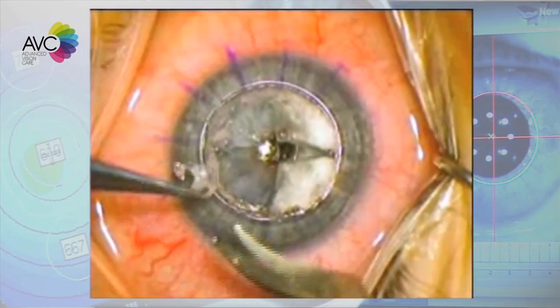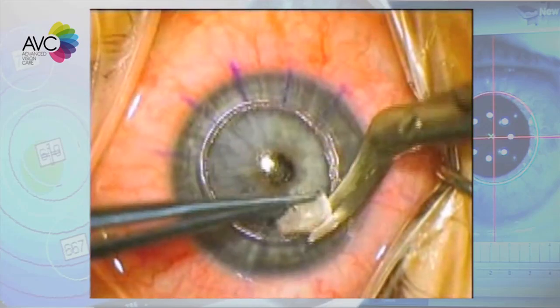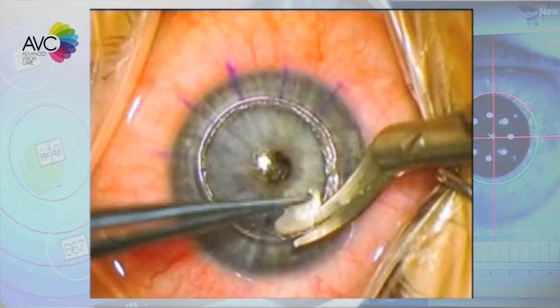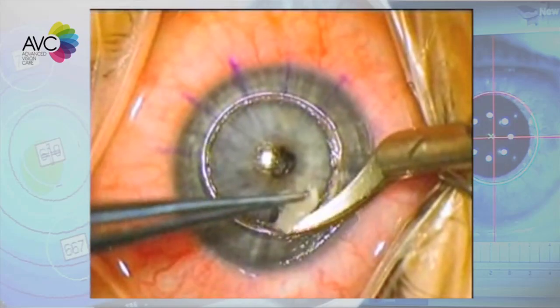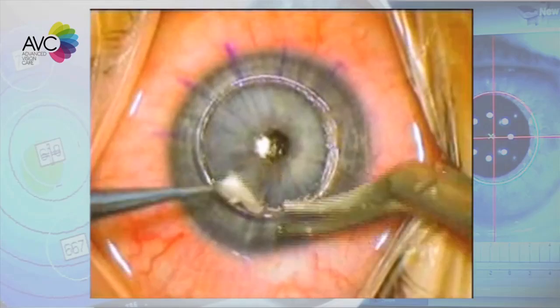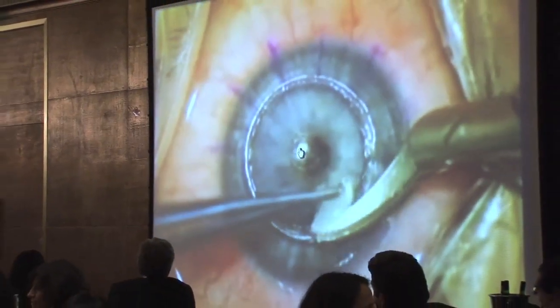All these instruments seem to be a little rough for such thin tissues. So that's why we are now converting to femtosecond technologies. But still, you see, the Descemet's membrane is in place with intact endothelium.